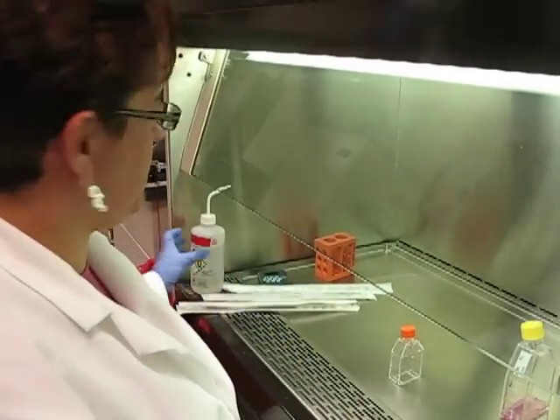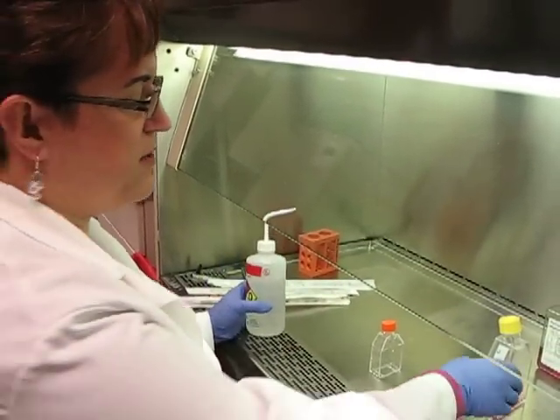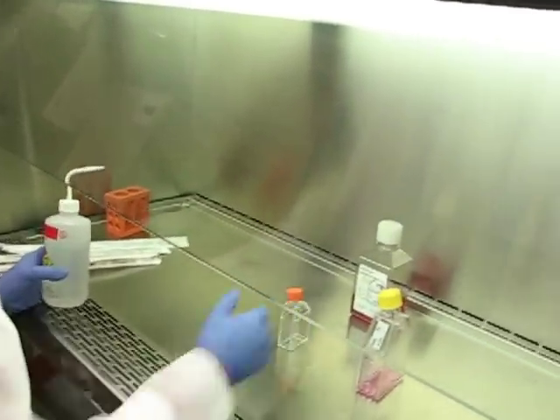I've completed my hemocytometer counts and done my calculations. I'm ready to transfer some cells to a new container.